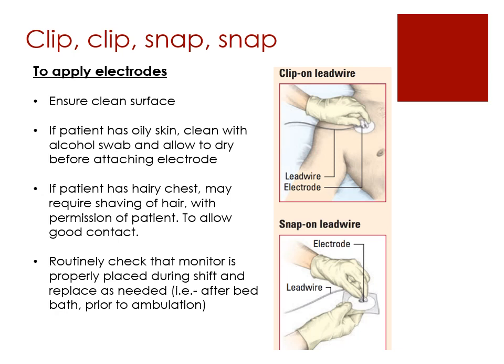If you have somebody who has a fairly hairy chest, sometimes it's easier to shave it so that you really get good contact, because what happens is the hair sticks to the electrode and it causes the electrode to move because it's sticking to the hair instead of to the skin. So sometimes we do have to shave some of our patients in those areas. Don't shave the whole chest, just the area where you're going to put the electrode.